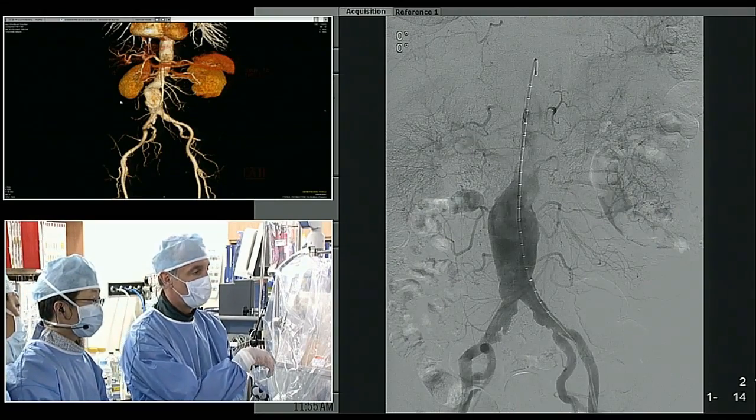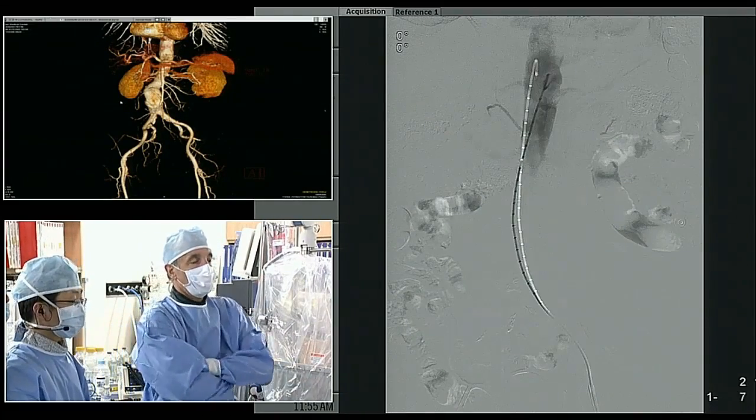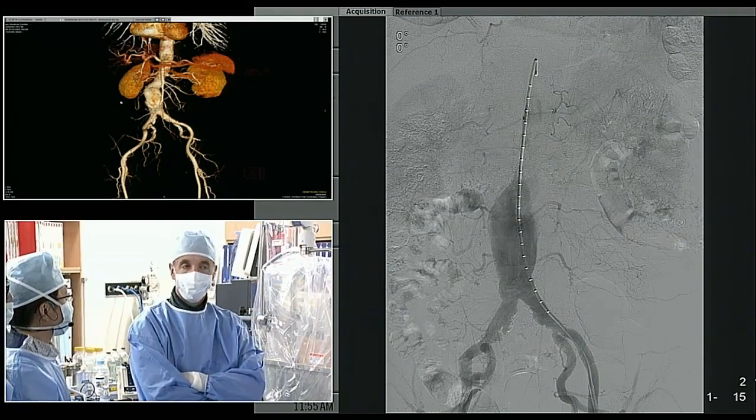The patient history described abdominal pain, and the pain was related to the aneurysm. Not too bad, though. I don't think so. He doesn't think so.